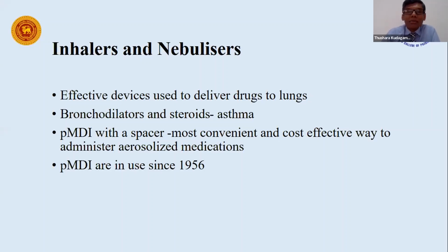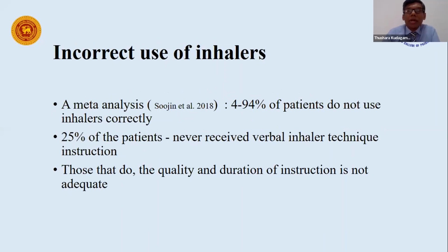So we all might feel that we know these devices in and out. But the ground reality is different, where studies have shown that up to 94% of patients do not use inhalers correctly.